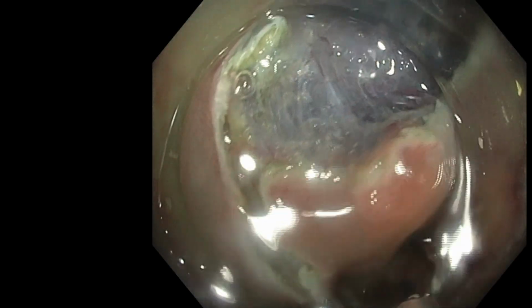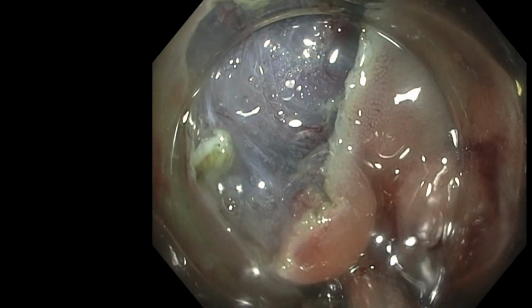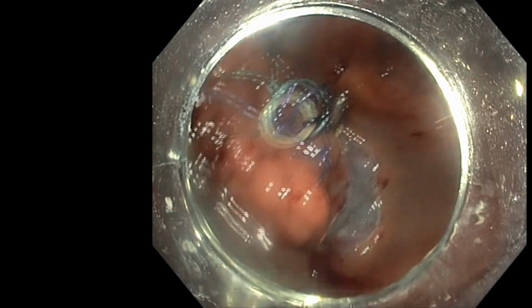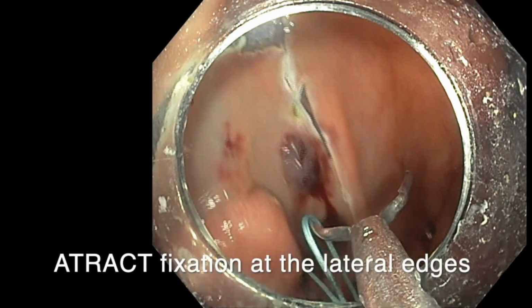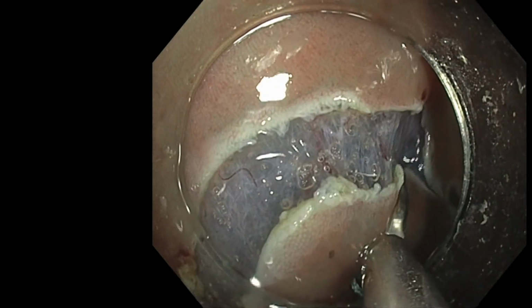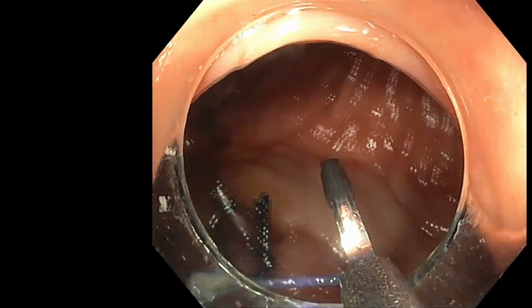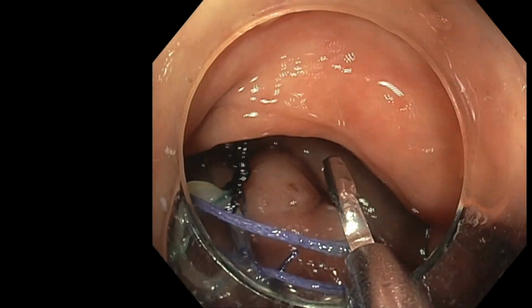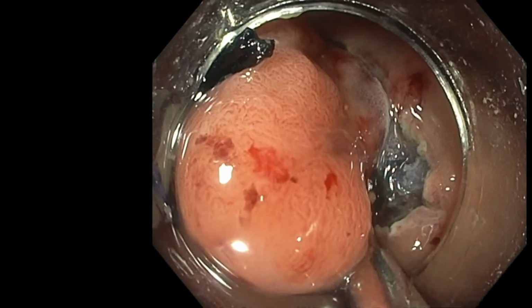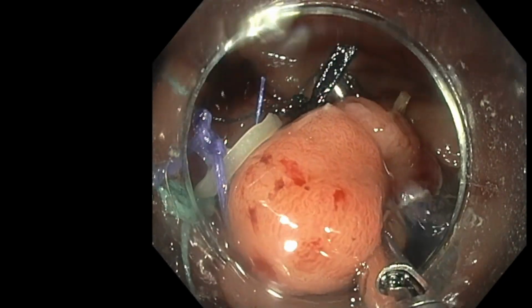Therefore, I did my anal incision with a relatively deep incision from the beginning. Once it's done, I fix the device on the anal edge for the second part, and on the two sides to have a kind of four-polar traction on the two edges and the two sides of the lesion. You will have a first traction to the center thanks to this four-point traction. It will expose the margins of the lesion, facilitating the trimming and the access to the submucosa.